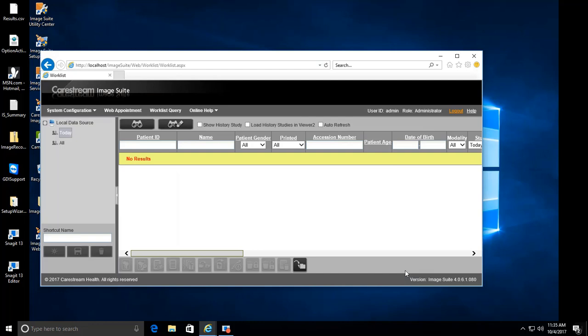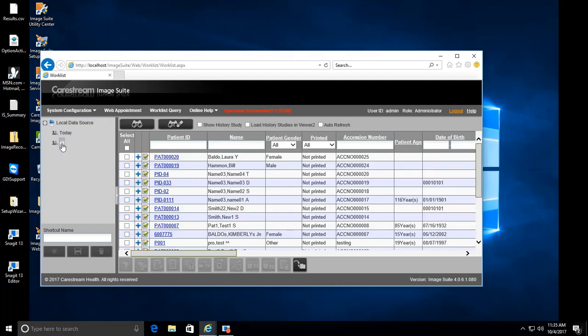On the left-hand side, click on the All button. Your patient will now appear in the Worklist.